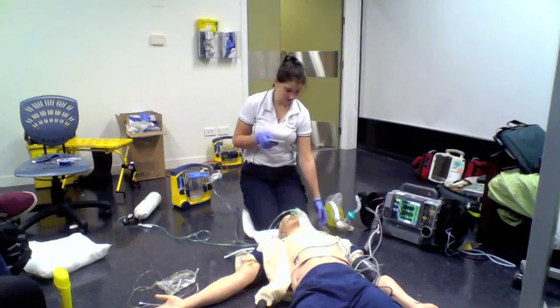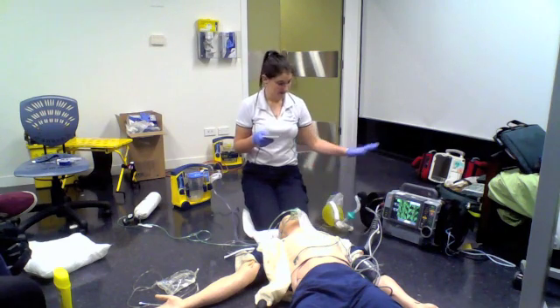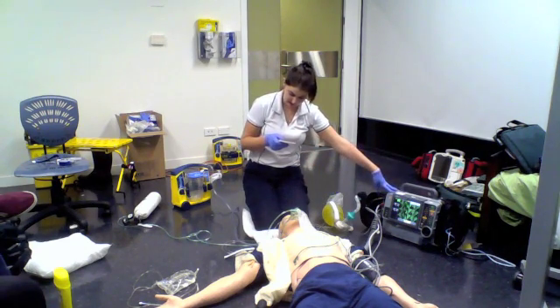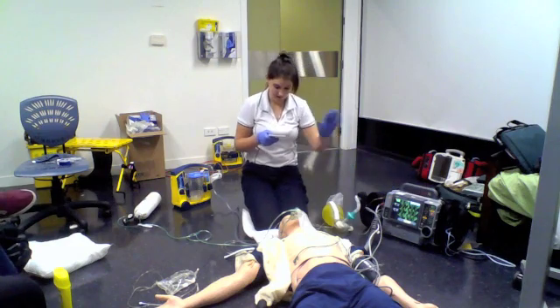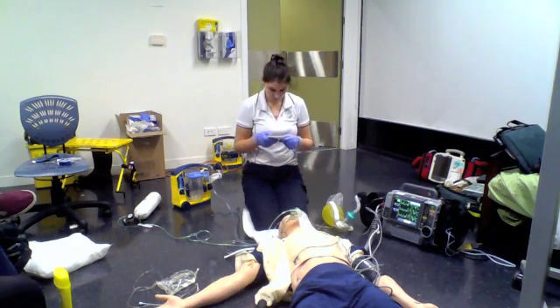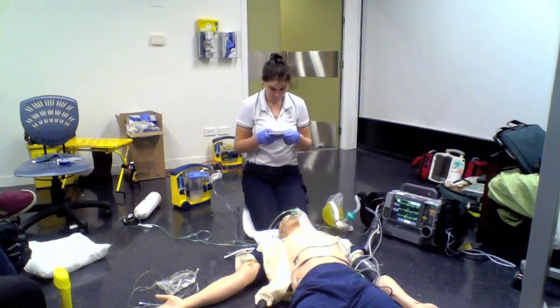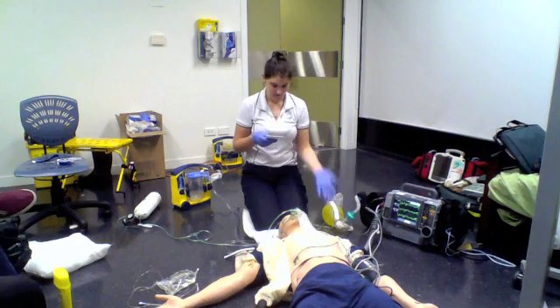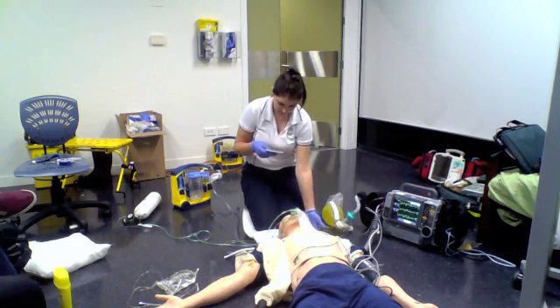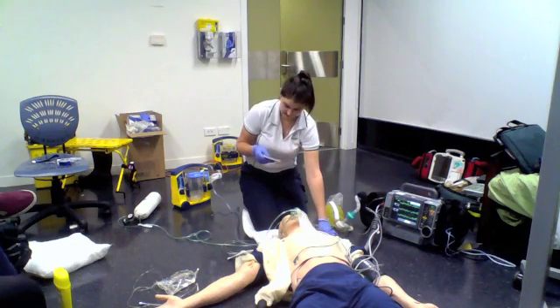We've got the ETCO2 tube on. We've positioned the monitor where we can see it, leaving the space to the right of the patient's head for the intubation role. We've gained access in 2 sites. We've prepared a saline for fluids. We've placed a towel under the head. We've placed an ET tube holder under the head.